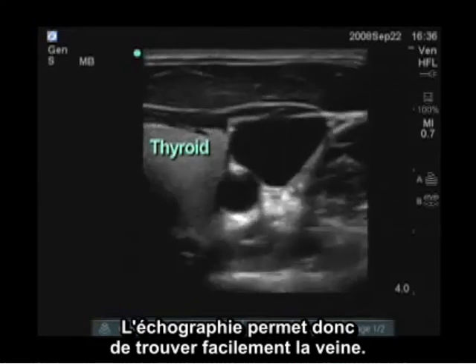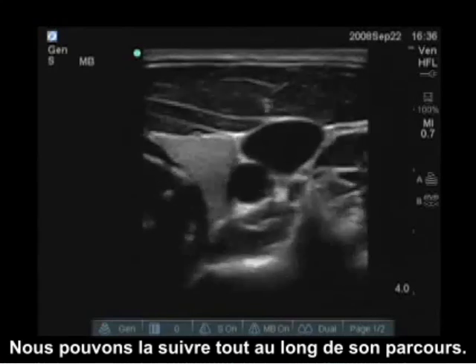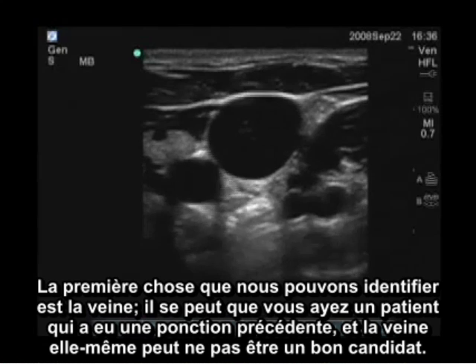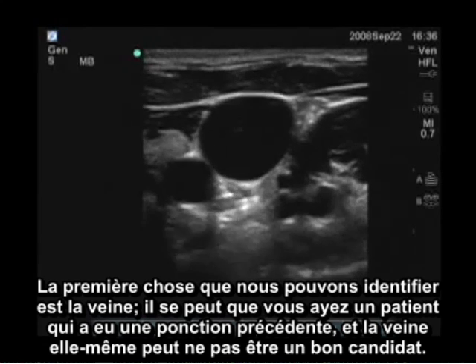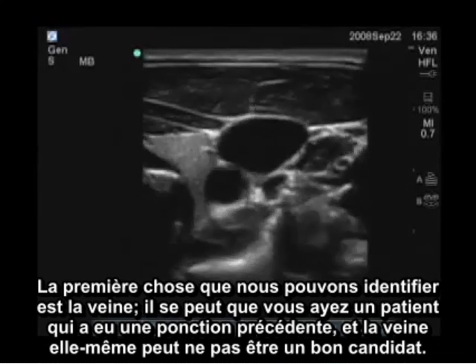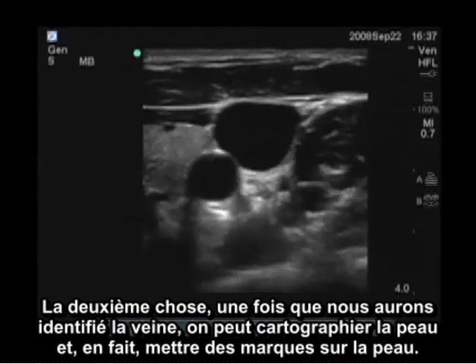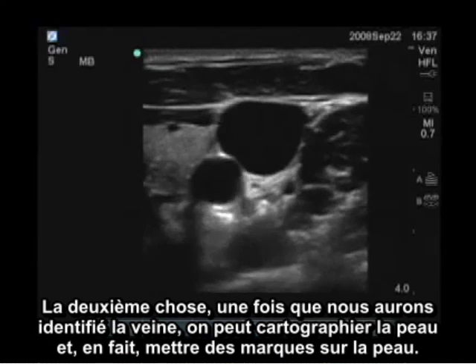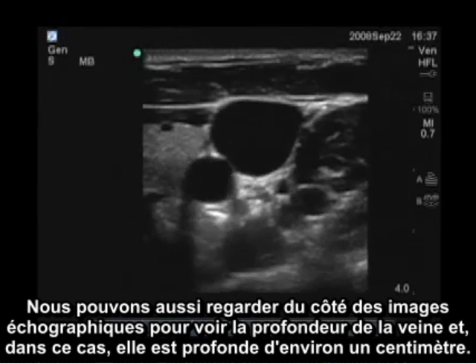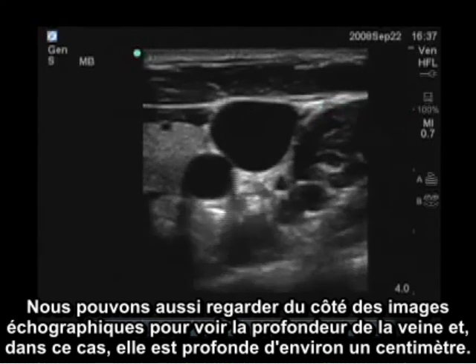So the ultrasound allows us to easily find the vein. We can track it along its entire course. First thing we can identify is whether the vein is patent. You might have a patient who has had a previous cannulation, and the vein itself may not be a good candidate. The second thing, once we've identified the vein, we can map the skin and actually put marks on the skin, and we can also look at the side of the ultrasound image to see how deep the vein is. And in this case, it's about 1 centimeter deep.